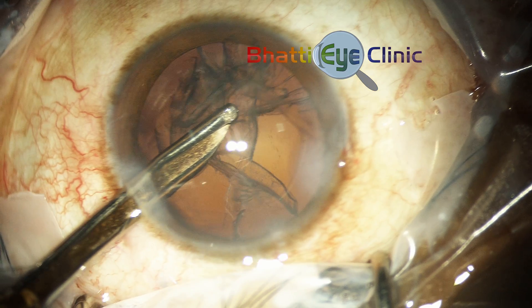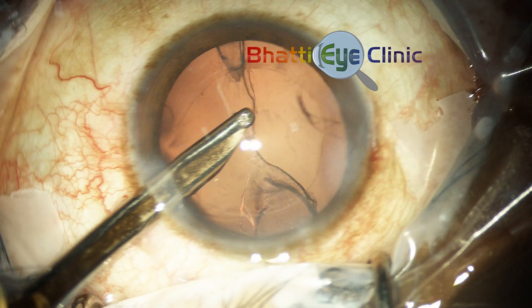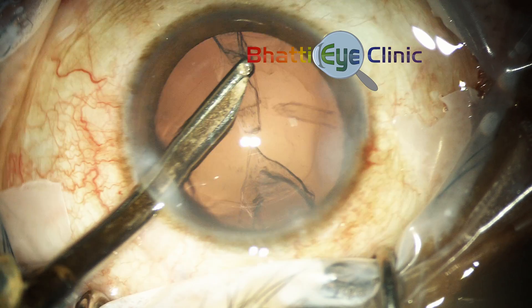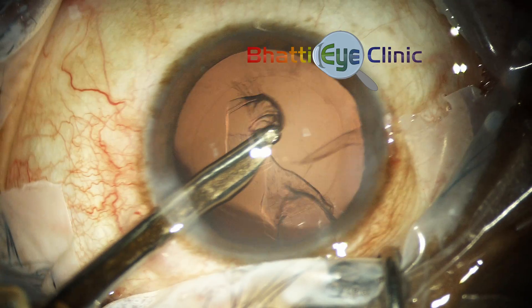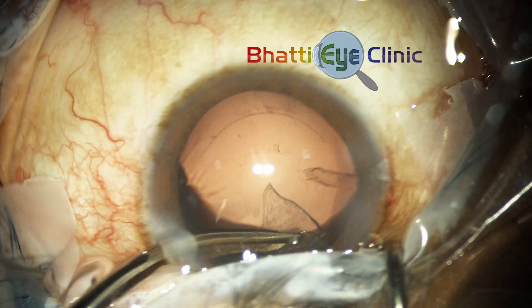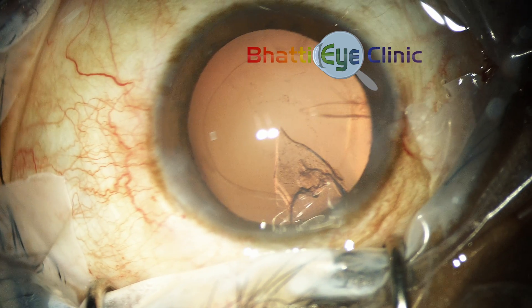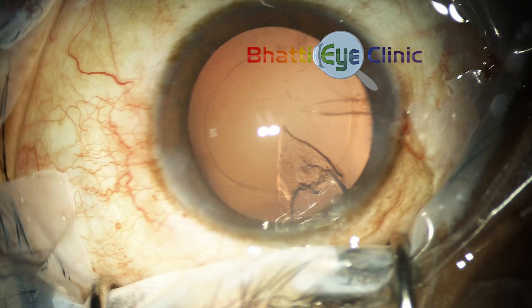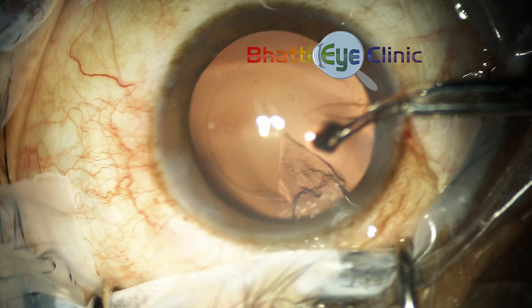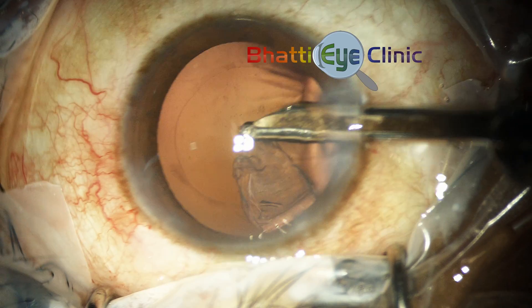Here again you can see the cannula being maneuvered under the anterior leaf of the cortex, and then the cortex is stripped to the center and removed by increasing the suction. If it's difficult to access the anterior leaf from one of the ports, the other port can then be used to strip the cortex.